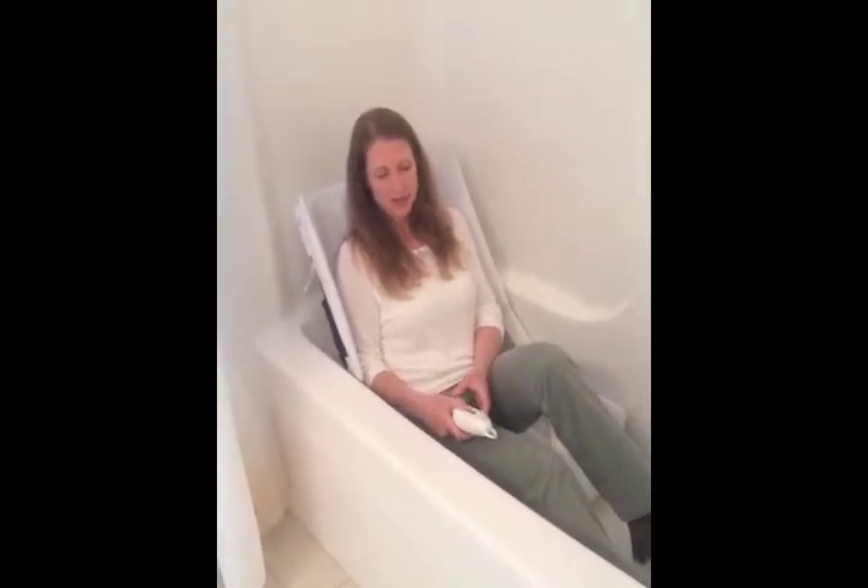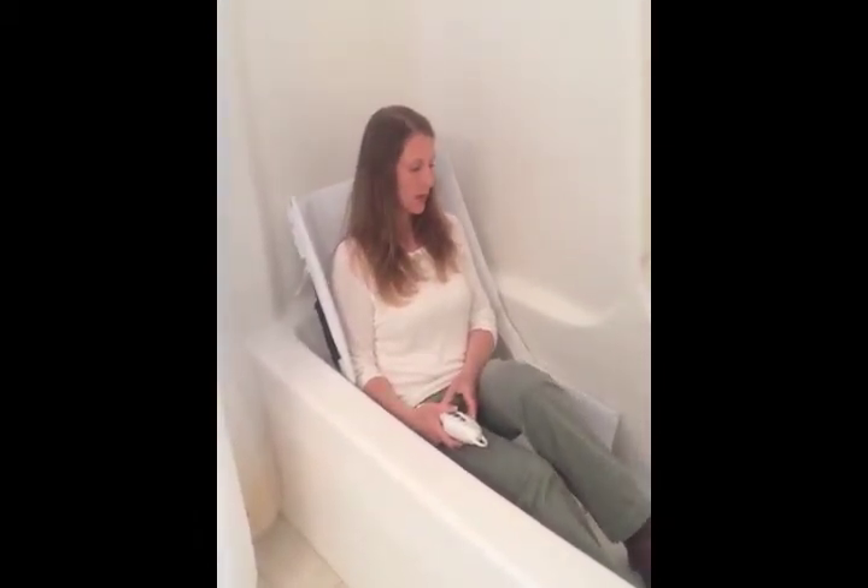Sometimes people like to position themselves differently than what this lift will allow. With a reclining bath lift like this one, the seat reclines — it doesn't stay up unless you keep it out of the water a little bit. This goes down to about two inches above the tub surface.